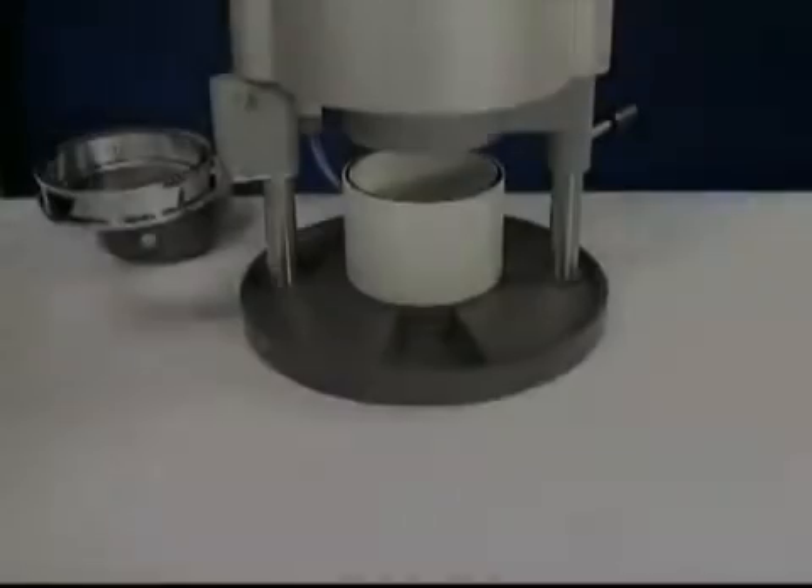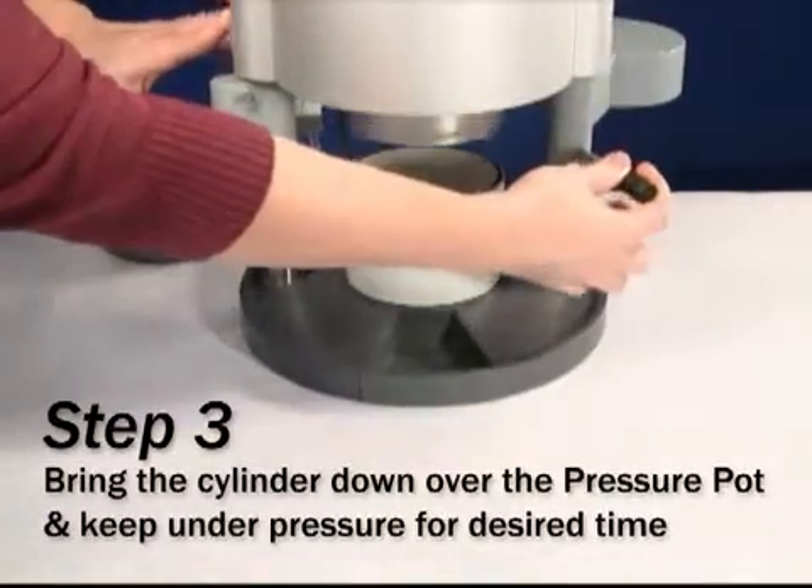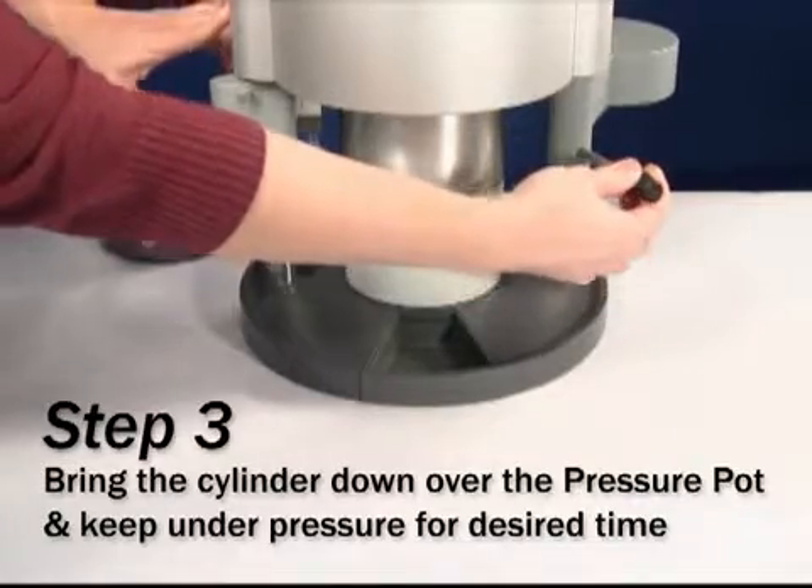Using the handle on the right, swing the heating element away from the center of the drufomat scan. Bring the cylinder down over the pressure pot.